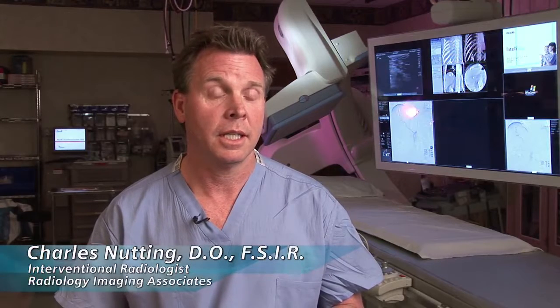Reproducibility and standardization of methodology is something that has plagued imaging response for a long time. Tumors grow in very amorphous distributions. And that's why if we had some kind of volumetric data to look at, it would be much more precise than a single or two-dimensional measurement. So we need something that's going to be fast, something that's going to be accurate, that kind of takes that human element out of it.